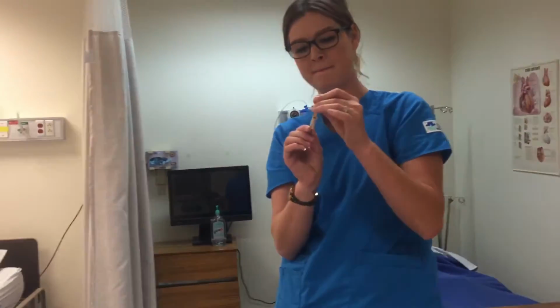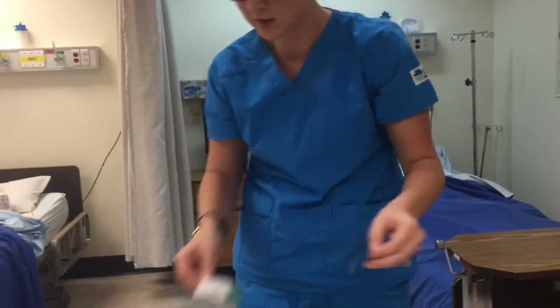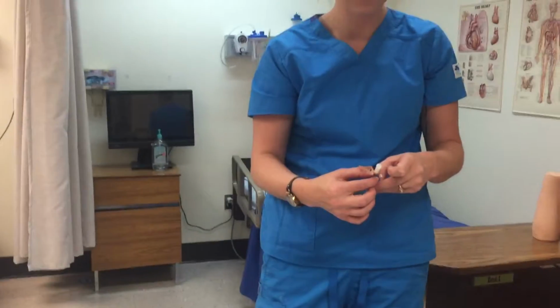Okay, so I'm going to use the scoop method. Put the lid on that. Label it with the medication dose, initials, time, and date. Put on the back half of my syringe.